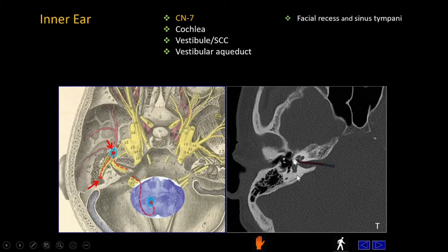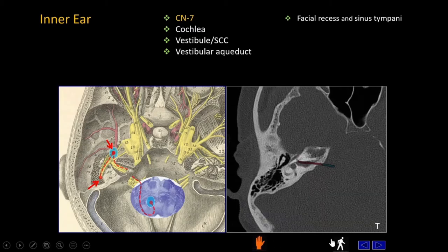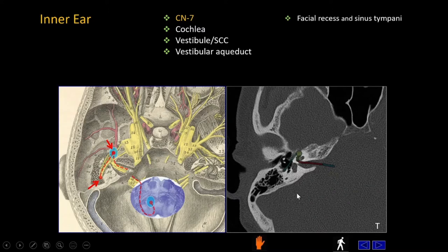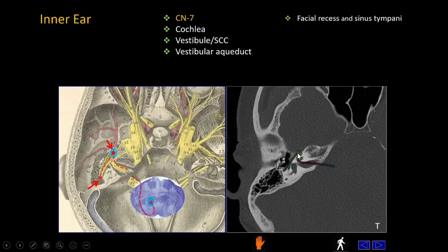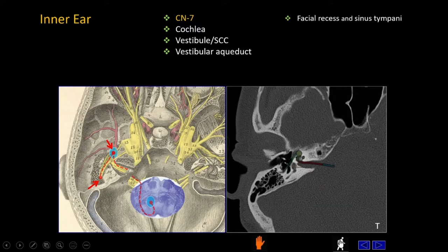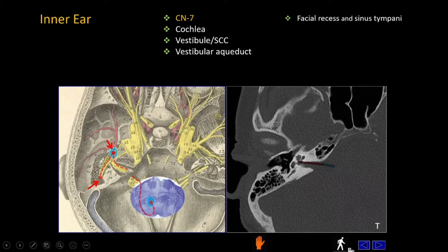The internal auditory canal takes an anterior bend — that's the geniculate ganglion. It takes a sharp anterior genu, extending into the tympanic segment, then becomes the posterior genu and takes a sharp dive from superior to inferior into the mastoid segment.